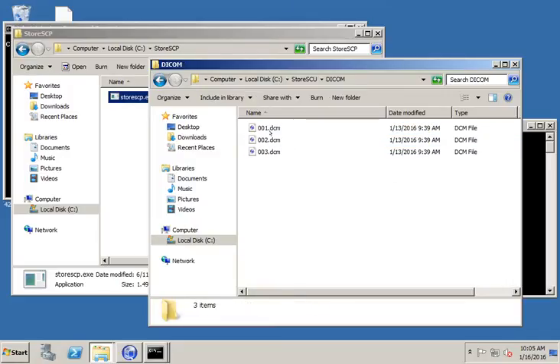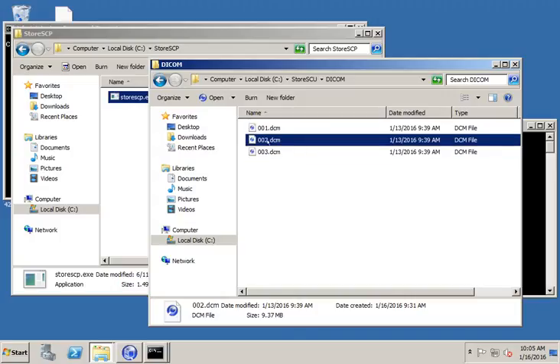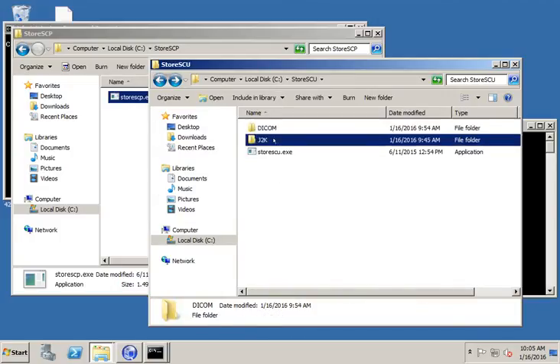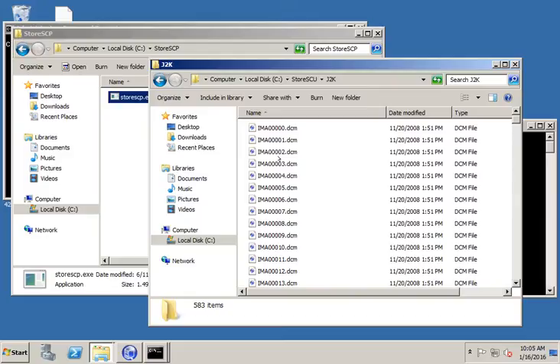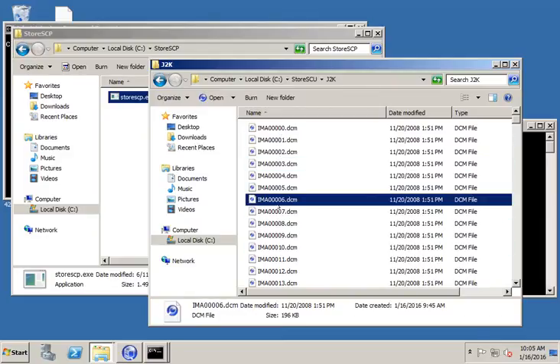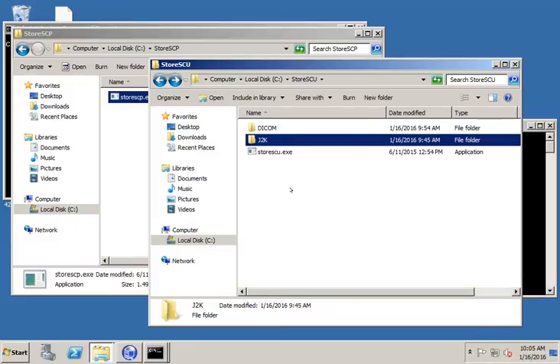I have two types that I downloaded just to give you an example. One is I have a couple of CR images that are implicit little endian, meaning they're not compressed. And then I have a few JPEG 2000 images that are compressed. So these are CT images which are compressed and there's a whole bunch in here.